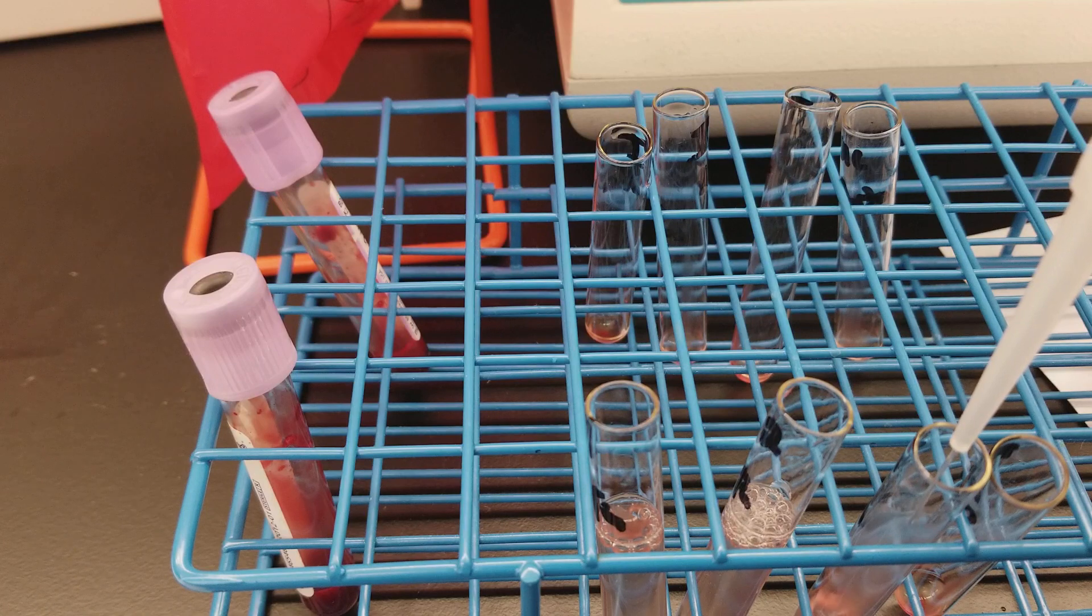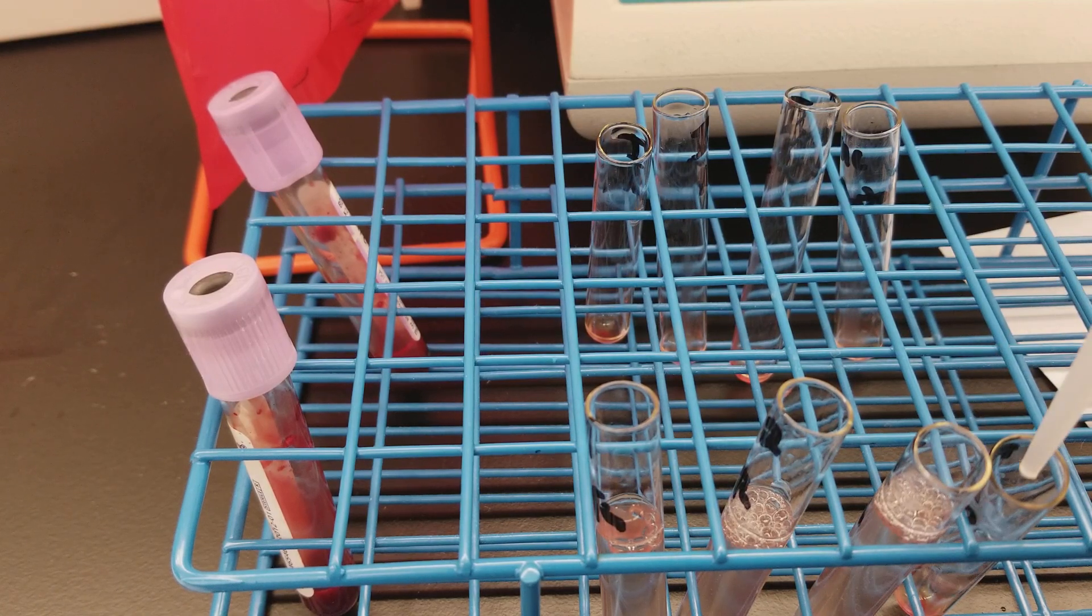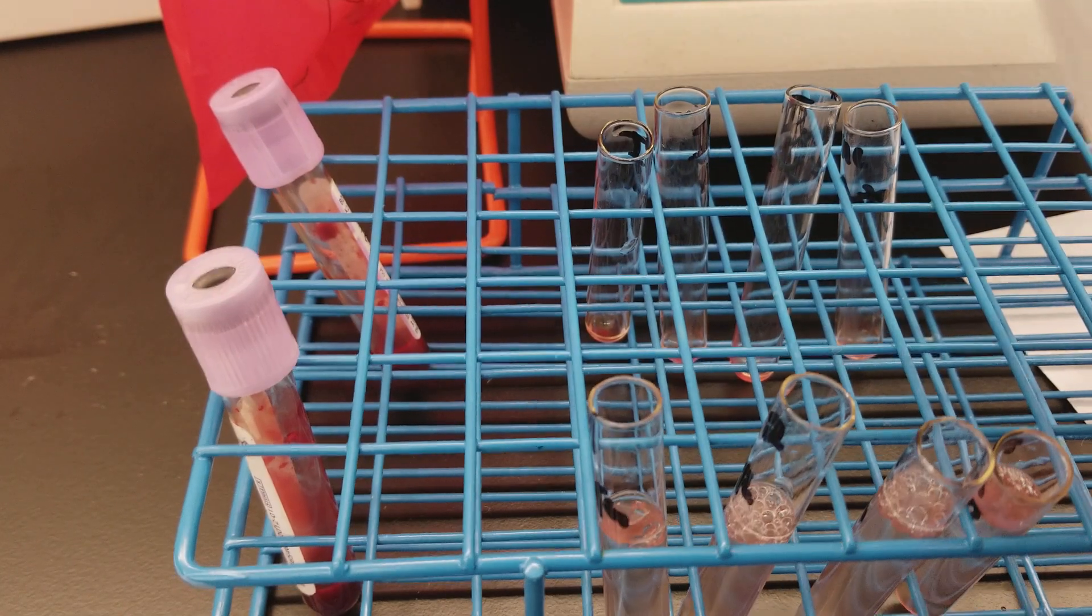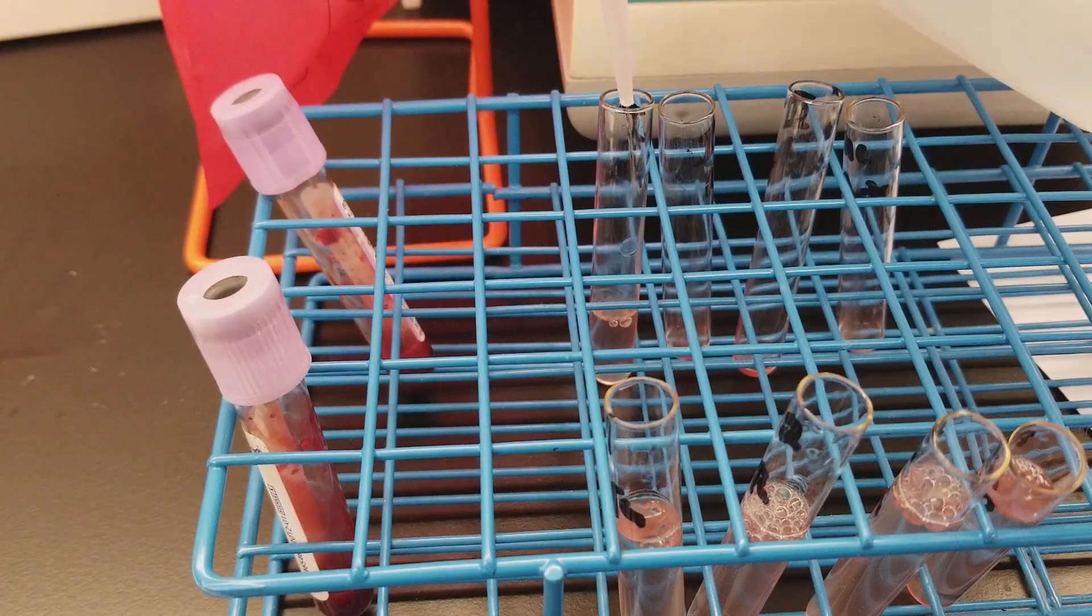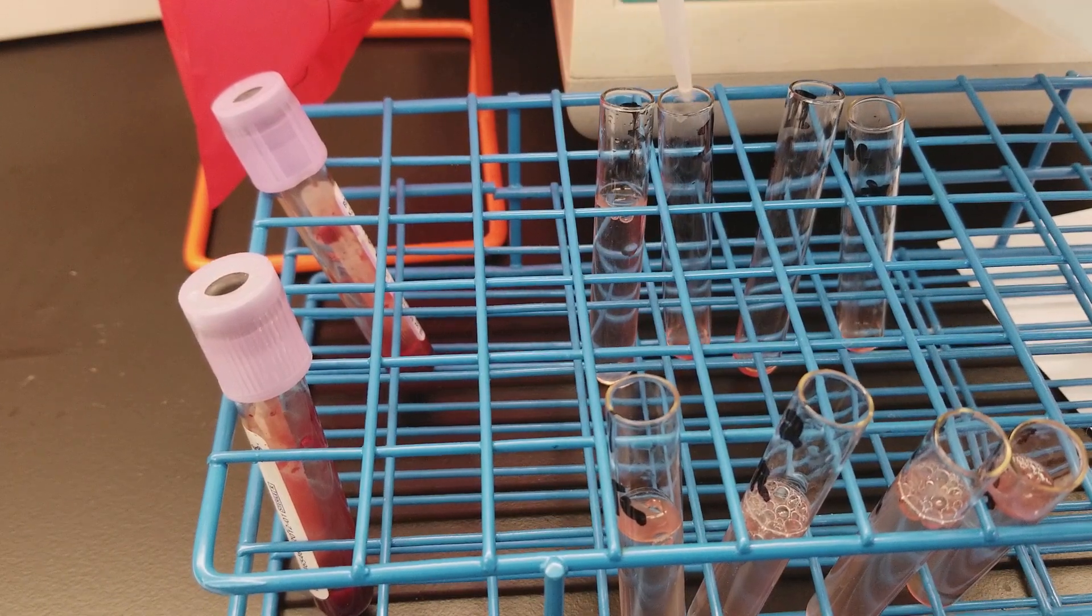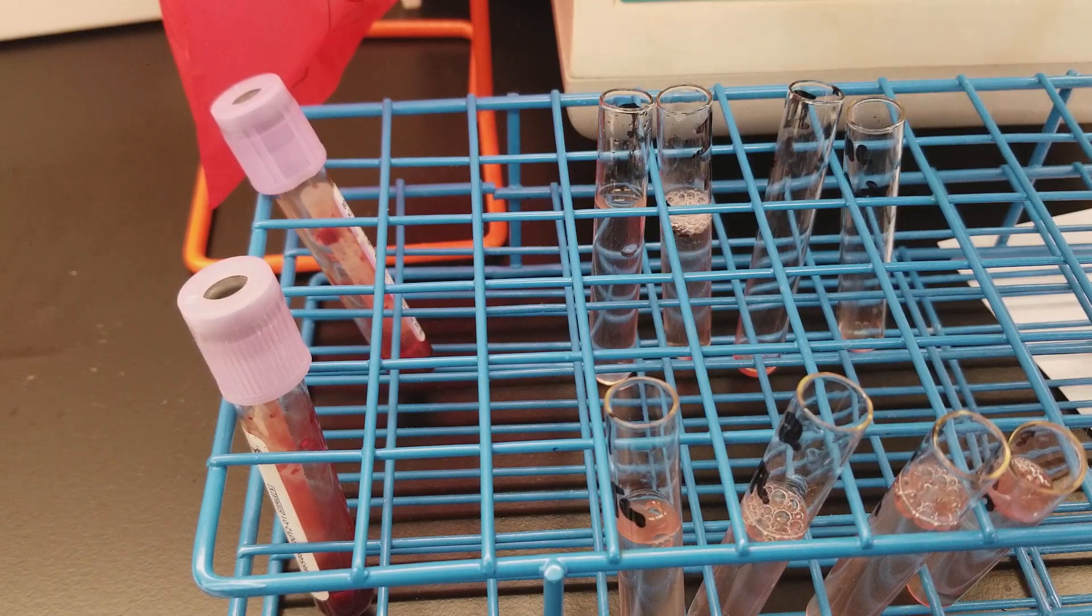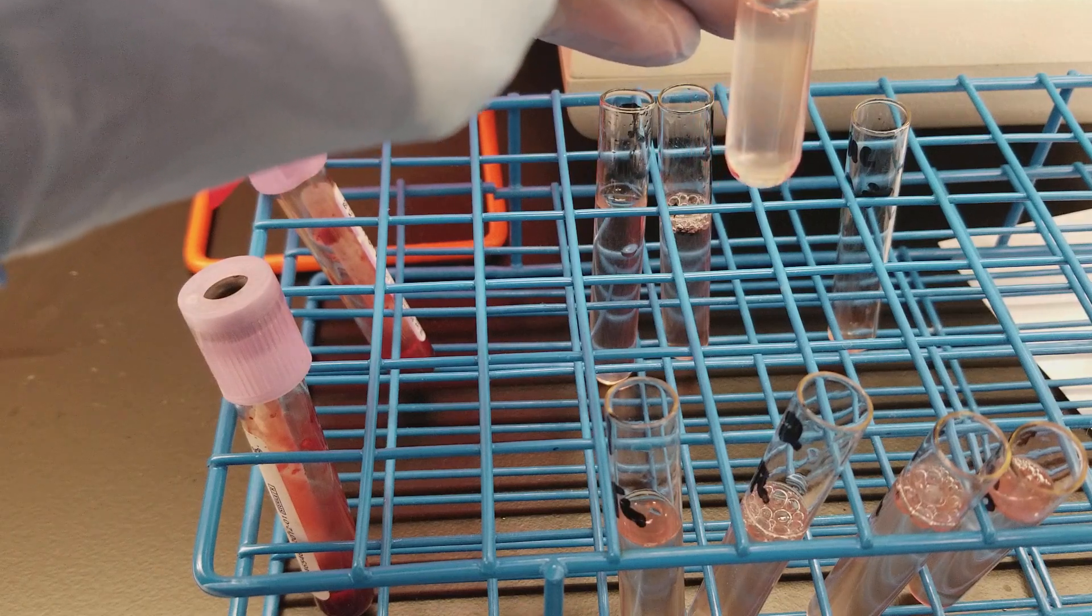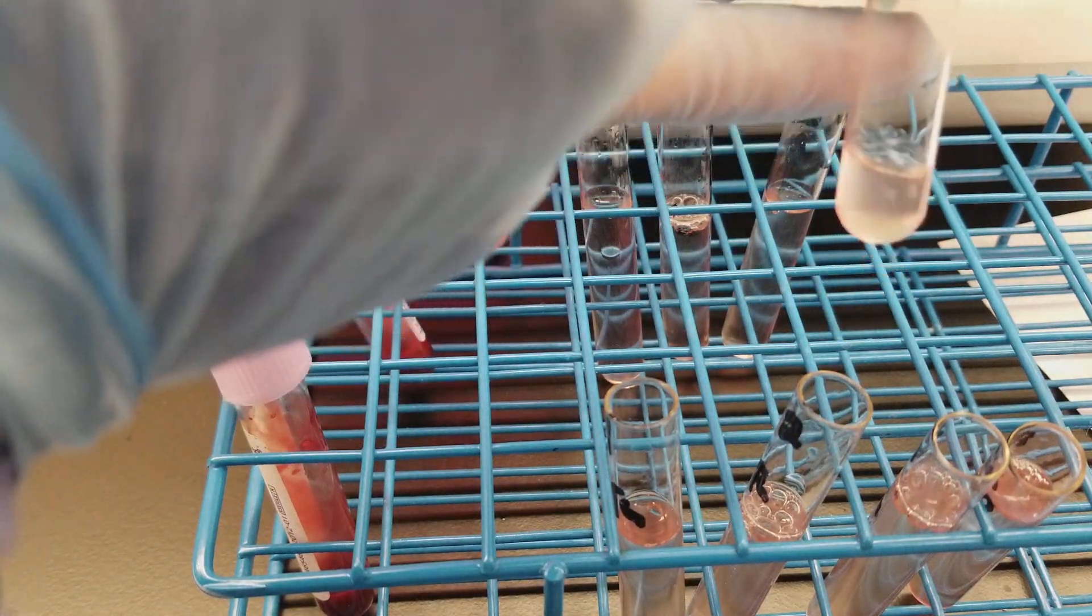So we're adding the saline for the second time, we're washing these cells the second time. What we're trying to do is get rid of any unbound antibodies that may be present in the suspension. So we had just added two drops of LISS and we incubated them at 37 degrees for 30 minutes. LISS is supposed to make it so that the incubation time goes down.